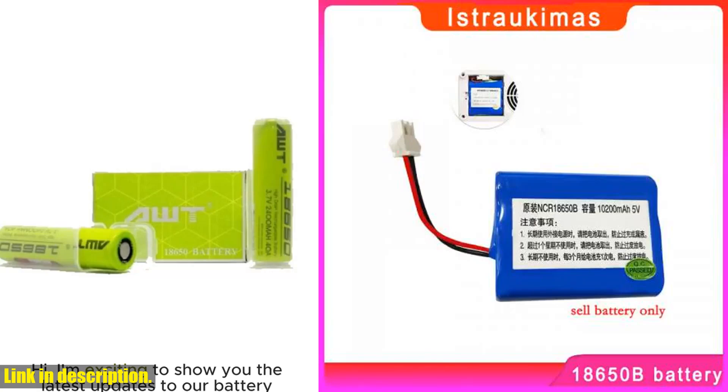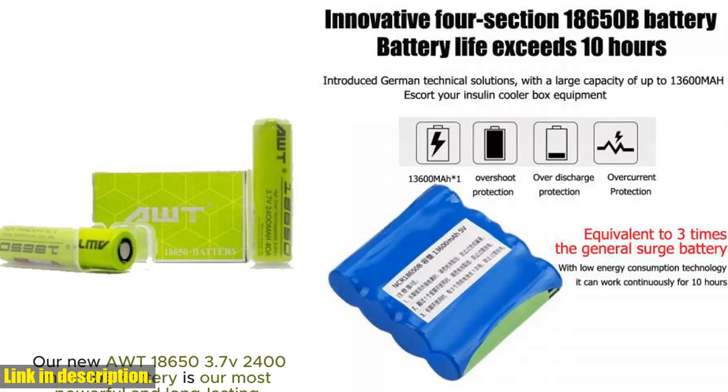Hello and welcome, my dear viewers. Today, we're going to talk about a game-changing product that will revolutionize the way you keep your insulin refrigerated.